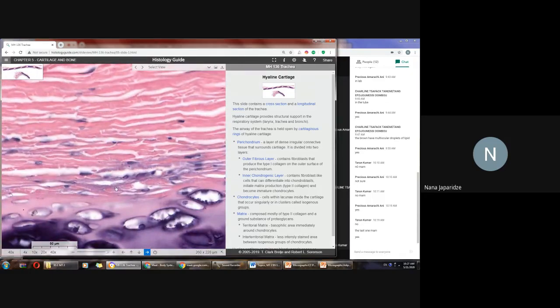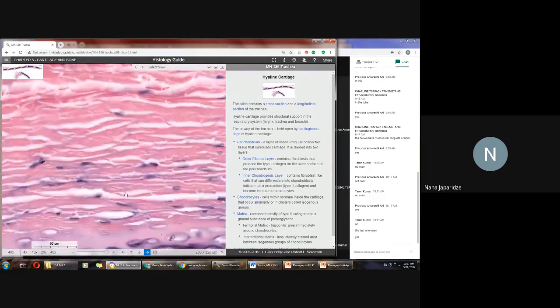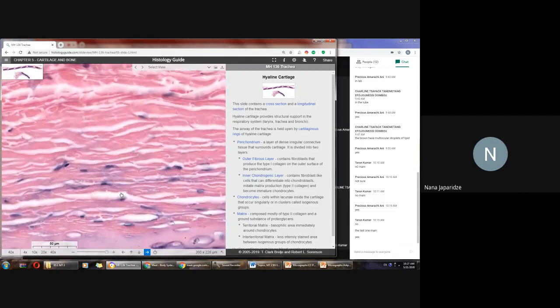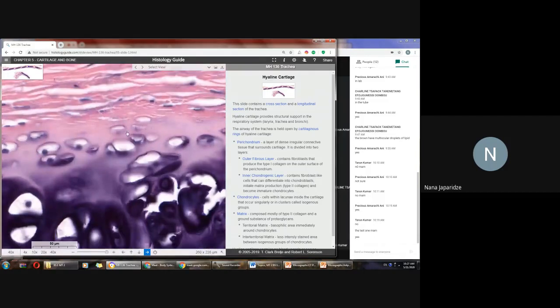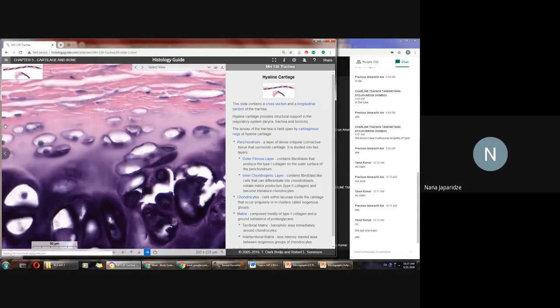And in the perichondrium, look, these fibroblast-like cells give rise to new chondroblasts. Chondroblasts start to produce extracellular matrix. At the same time, they divide. They are able to divide and give rise to the groups. And a new layer of cartilage tissue is formed. Okay.